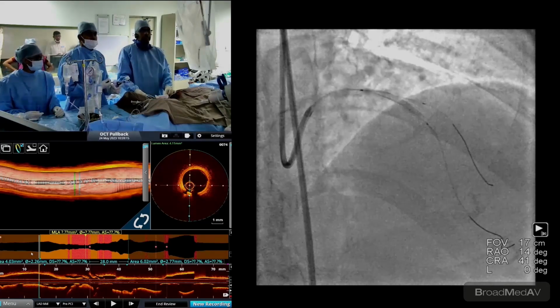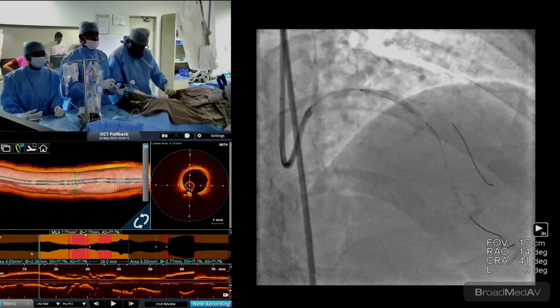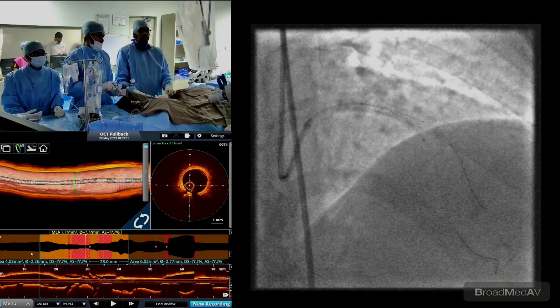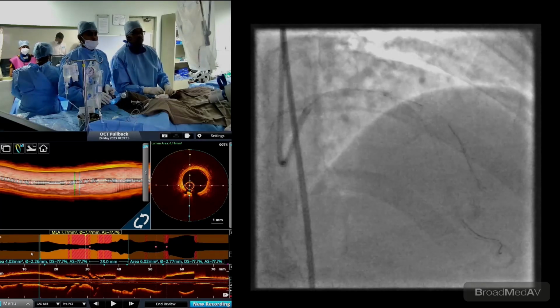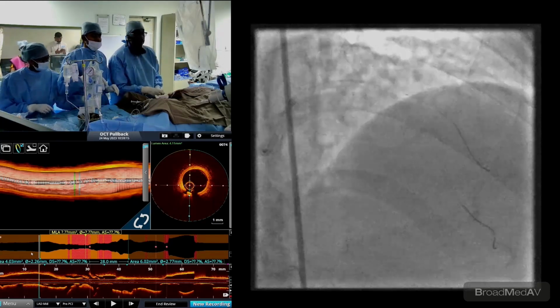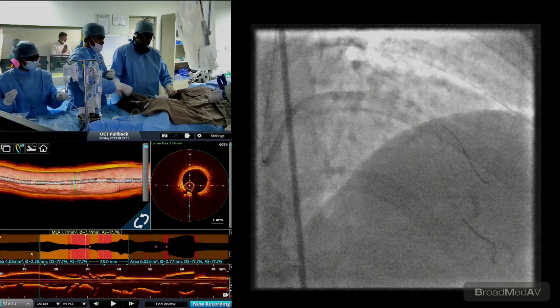So we have covered the mid and proximal part of the lesion at the diagonal. Go up please once again. And then we'll check whether we need anything to be done in the ostium part. And we keep the 2.5 balloon ready, sister, and a 3.0 for a POT. Keep a 3.0 balloon please for a POT. We'll take a shot and decide whether rewiring first or POT first.